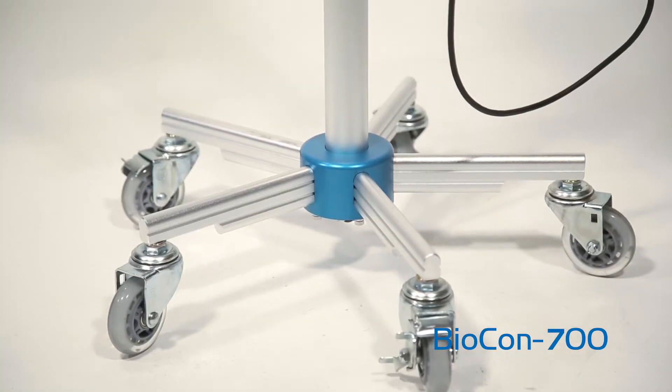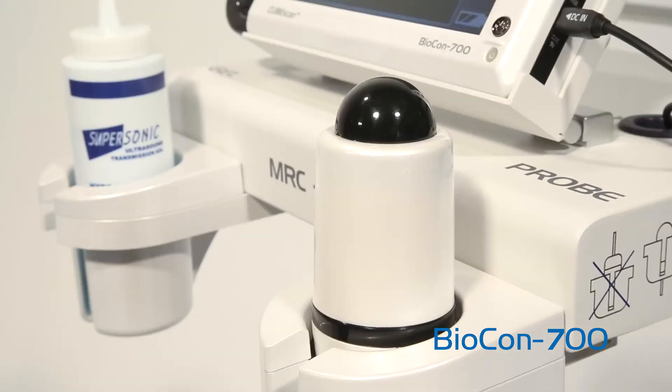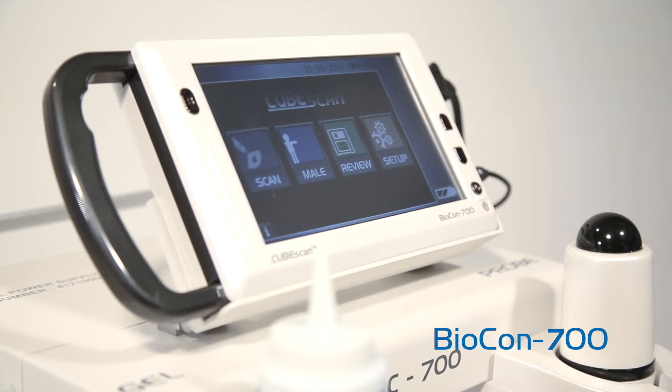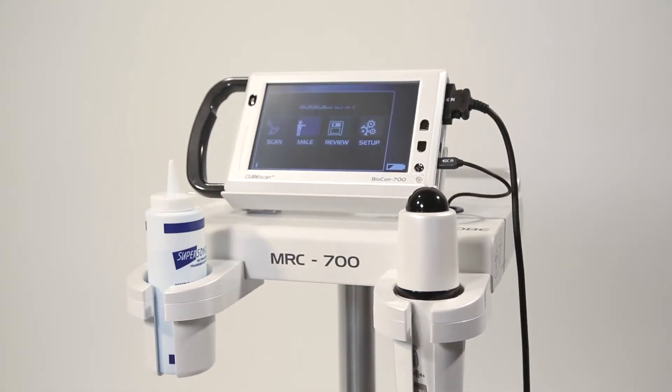Biocon 700 is an ultrasonic residual urine volume measuring device manufactured by M-Cube, specialized in voiding dysfunction. Let's take a look at how to use the CubeScan Biocon 700.